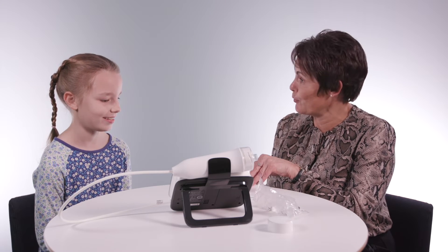So I just wanted to ask you, when you did the test, did you think it was easy or hard or in the middle? It was quite easy. Was it? Oh, that's good. And I think you did an absolutely brilliant job.